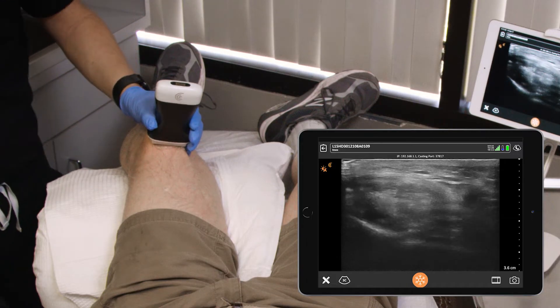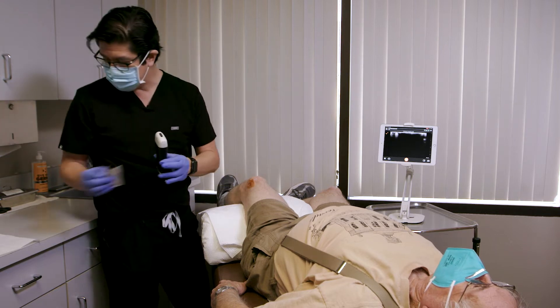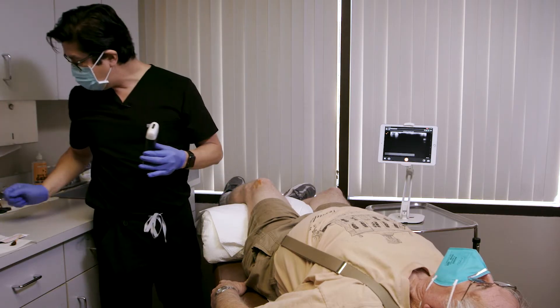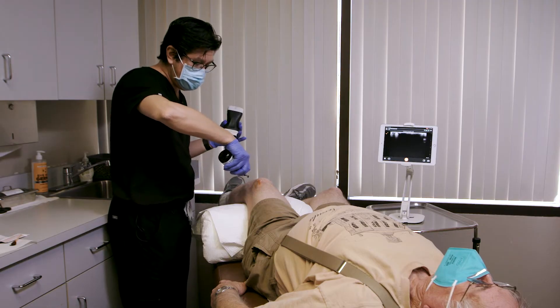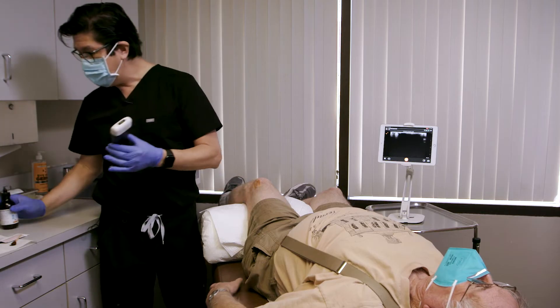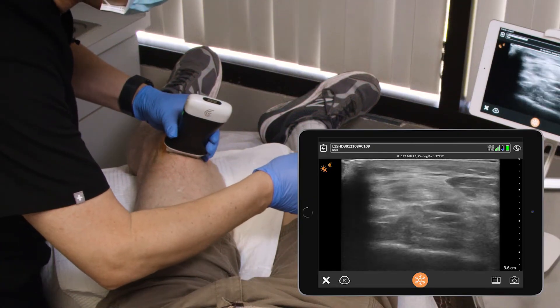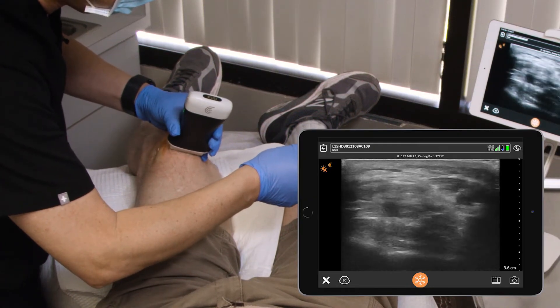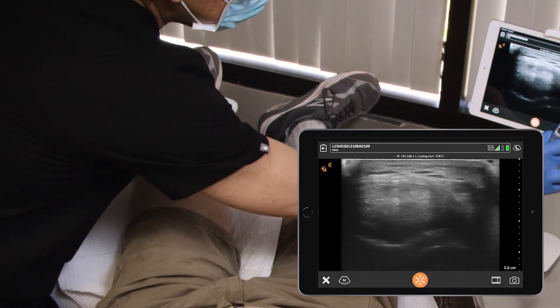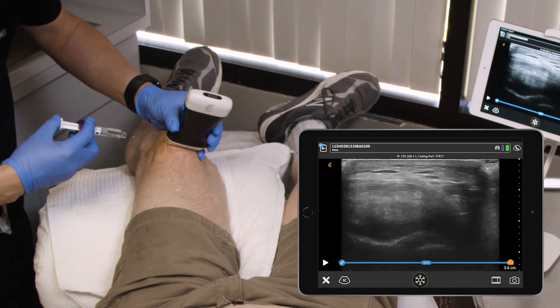So now we're going to get them cleaned up. I'm going to numb it up. Prepare for the injection. I'm going to put this on, make sure we're in the right spot. We're happy with our positioning. There's a good spot. Take a picture for recording the video and then entry.